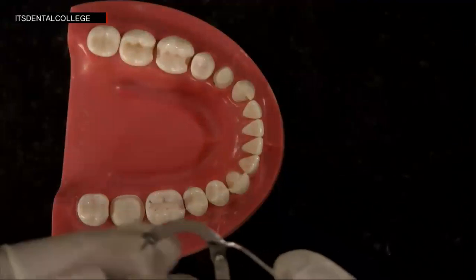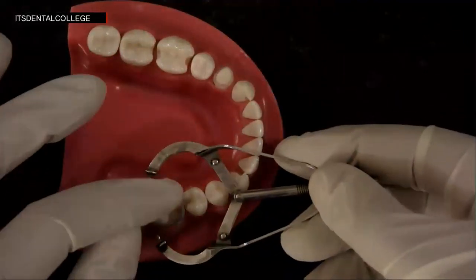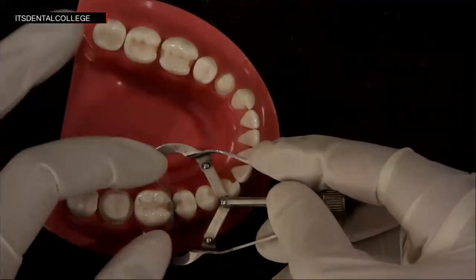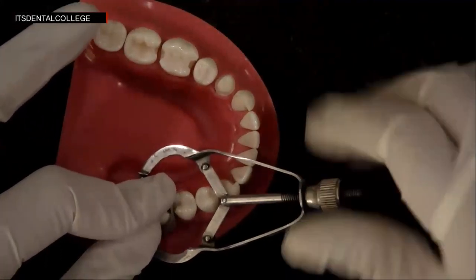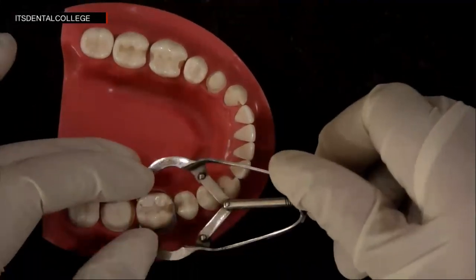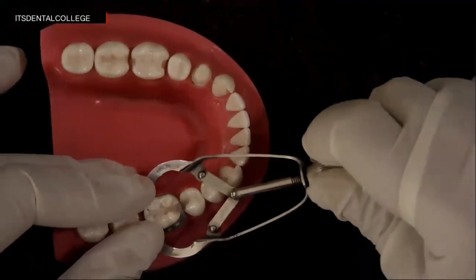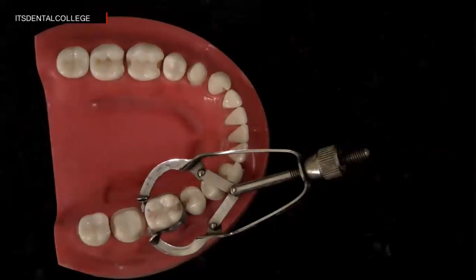And then the retainer will always be coming out of the mouth. And this will go interproximally. And then what we have to do is tighten it. Okay, so now we can see that the band is placed. The next step would be to place a wedge.